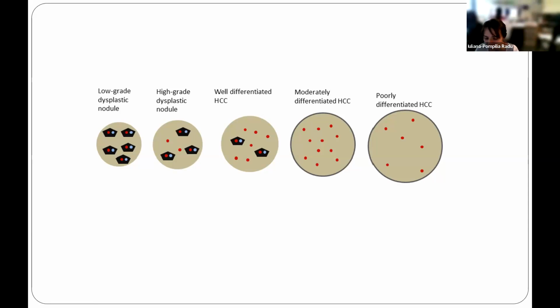And in the periphery, it remains enhanced. Also, there is edema. It's a bit more complex. So it remains hyperenhanced. We have like a ring all the time in cholangiocarcinoma, and a fast washout. This is faster, much faster. Okay.